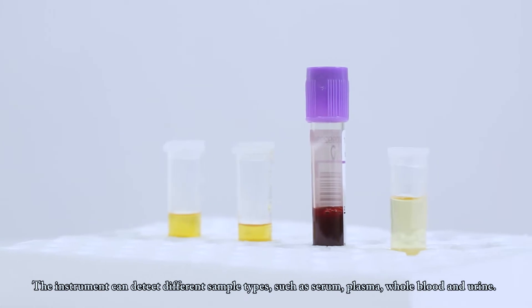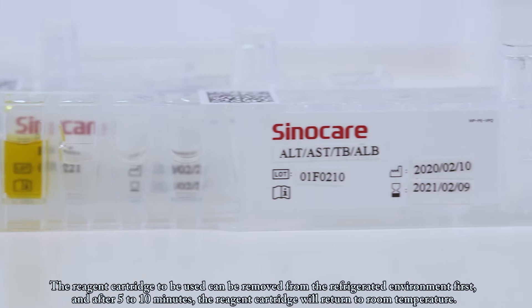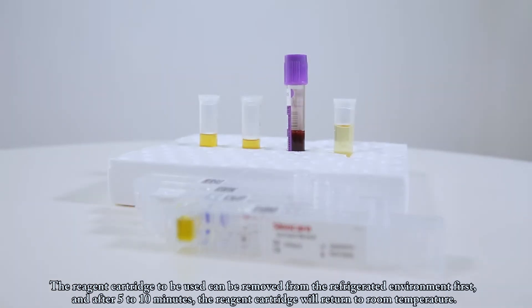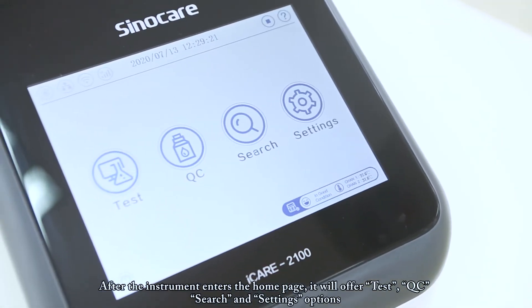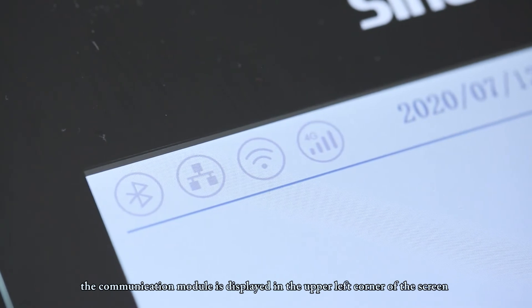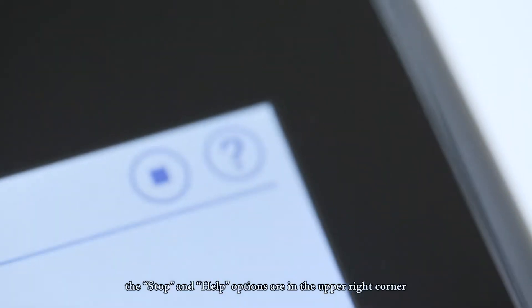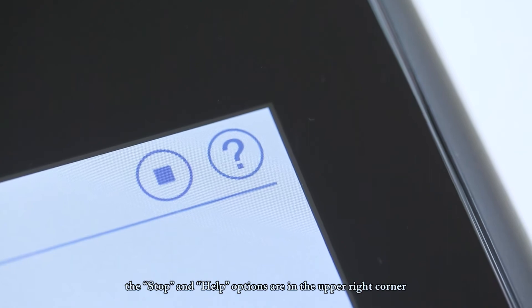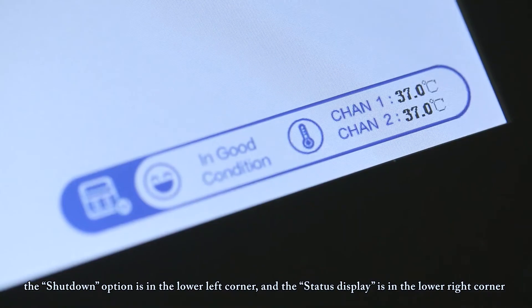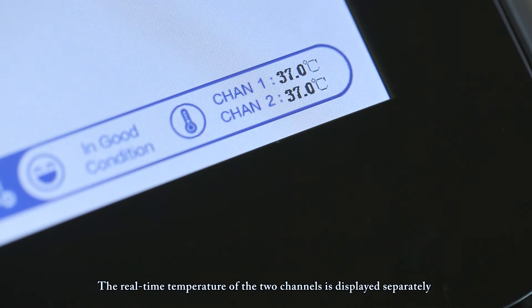The instrument can detect different sample types such as serum, plasma, whole blood, and urine. The reagent cartridge can be removed from the refrigerated environment first, and after 5–10 minutes it will return to room temperature. After the instrument enters the home page, it offers test, QC, search, and settings options. The communication module is displayed in the upper left corner, the current test time at the top, and the stop and help buttons in the upper right corner. The shutdown button is in the lower left corner, and status display and real-time channel temperatures are shown in the lower right.